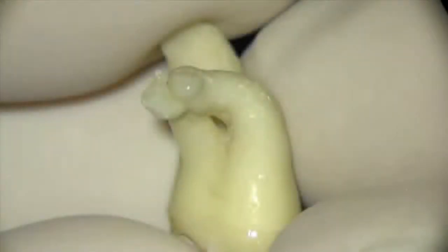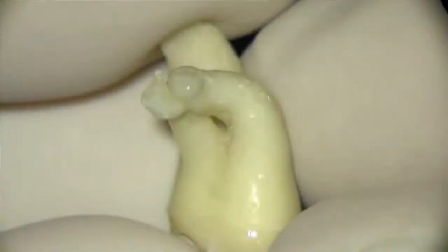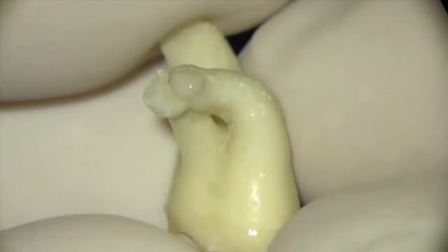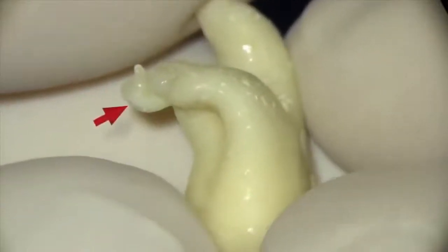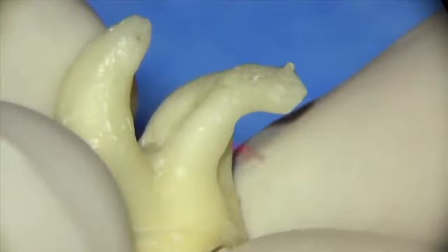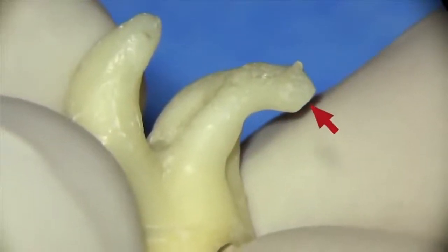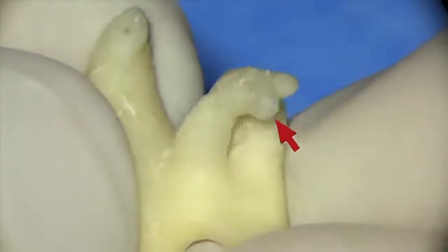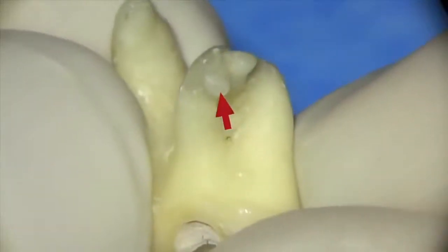The example I've chosen to showcase the new, improved, and advanced ProTaper Gold — and to demonstrate the predictability and safety in performance — is a maxillary molar with a double S turn. The canal and root, go buccal.